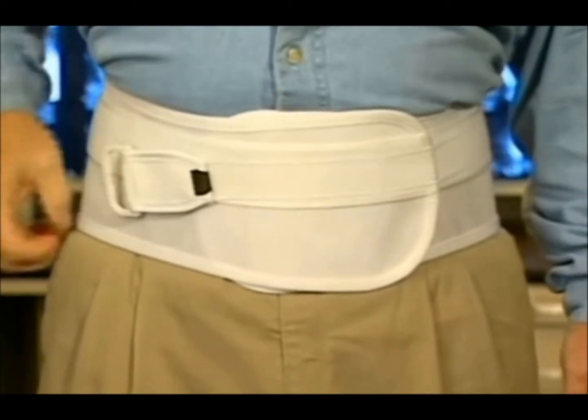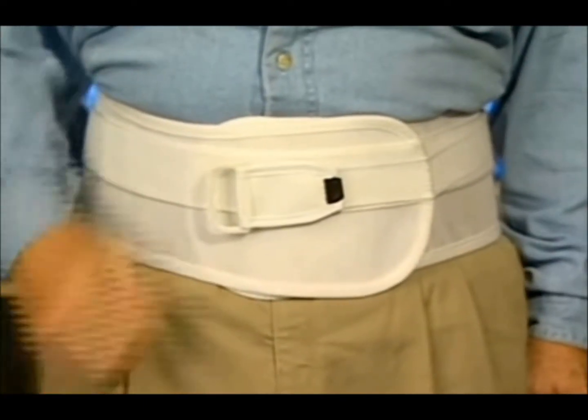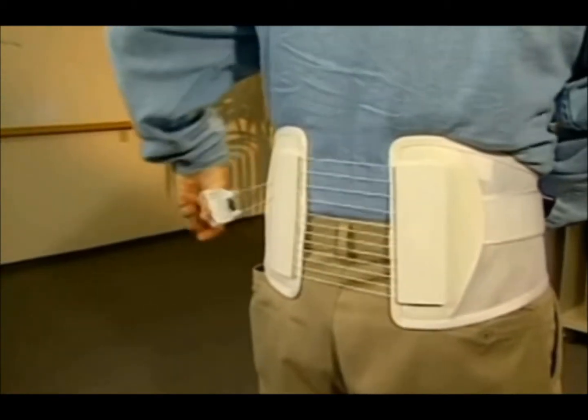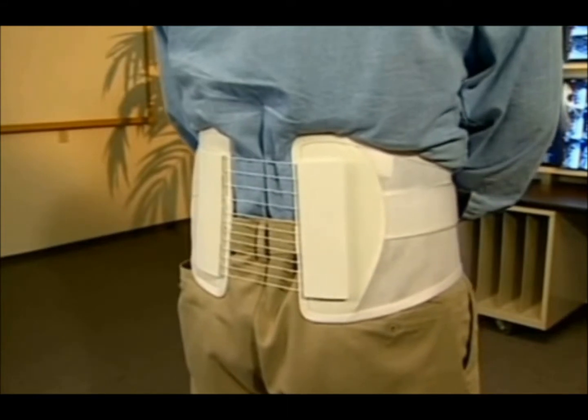Now, pull the handle away from the brace and across your body. Place the handle anywhere on the fabric fastener to achieve the support desired. This patented pulley system provides six times more power to support the back than other traditional braces.